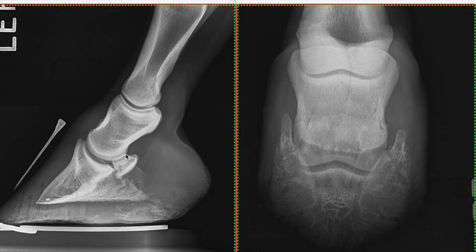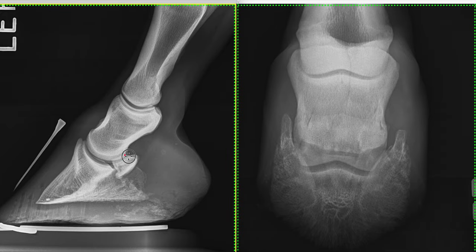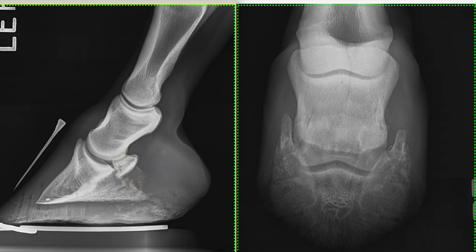Looking at our navicular bone, I would normally expect that we wouldn't extend our navicular bone — the flexor cortex wouldn't extend much beyond lines drawn parallel with the proximal and distal aspects. So you can see we have got some extension here of the proximal and distal aspects of the flexor cortex of the navicular bone. So that starts to ring some alarm bells for me.